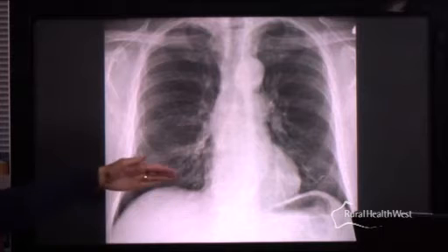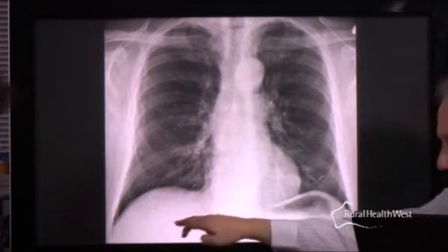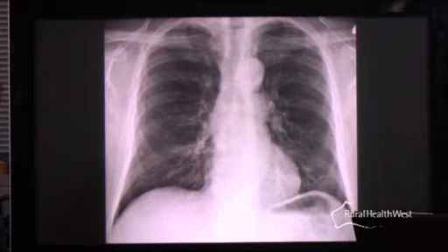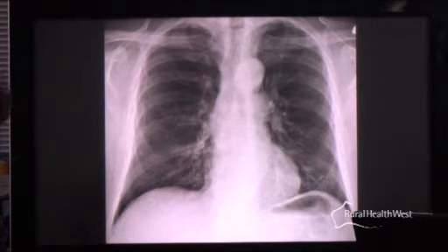That's because it's down behind this hemidiaphragm here. So if you've got pathology down here or down here, you're going to miss that. So certainly in an adult, you'd want to do lateral chest films. In young children, we often only do an AP or a PA film, and often because of the build of children, you can actually still see through the diaphragms and have a reasonable view of what's going on at the lung bases. But even then, if you're concerned that there is a basal pneumonia, you would probably want to get a lateral film.